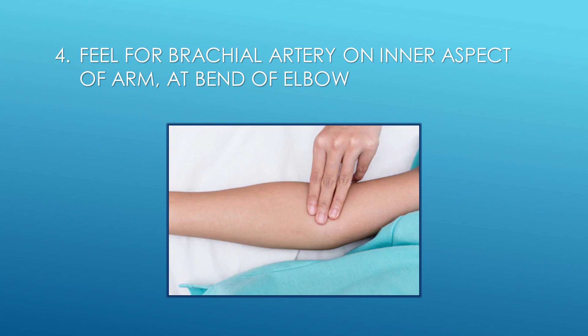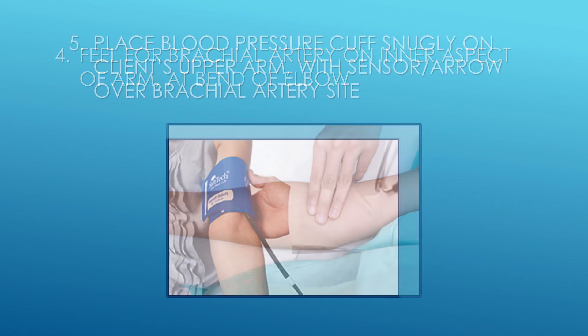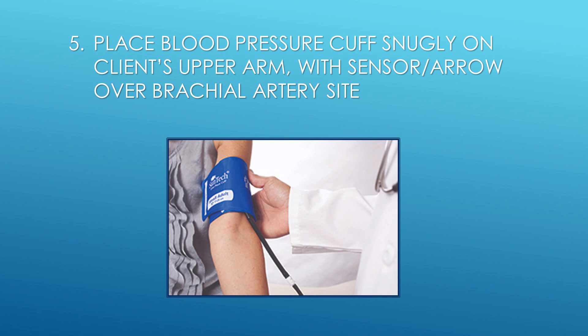Step 4: Feel for brachial artery on inner aspect of arm at bend of elbow. Step 5: Place blood pressure cuff snugly on client's upper arm with the arm sensor and arrow over brachial artery site.